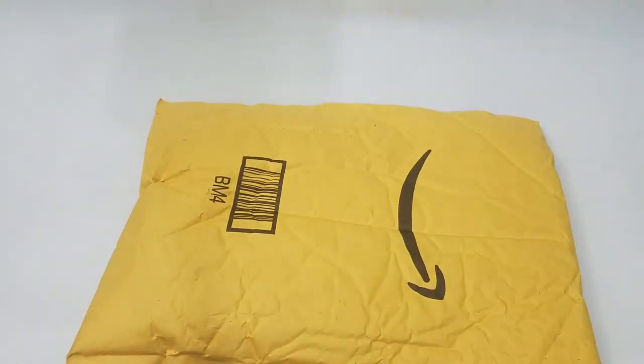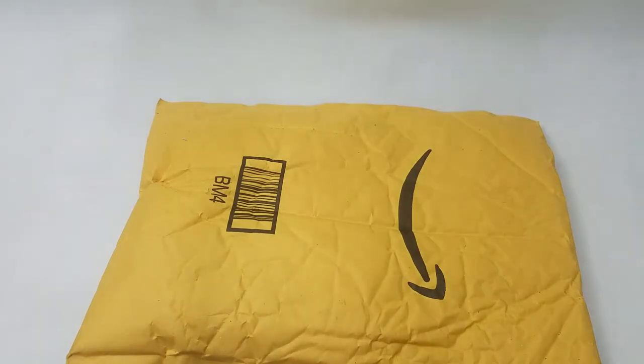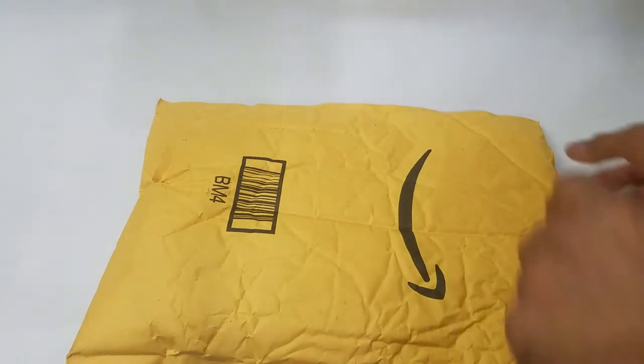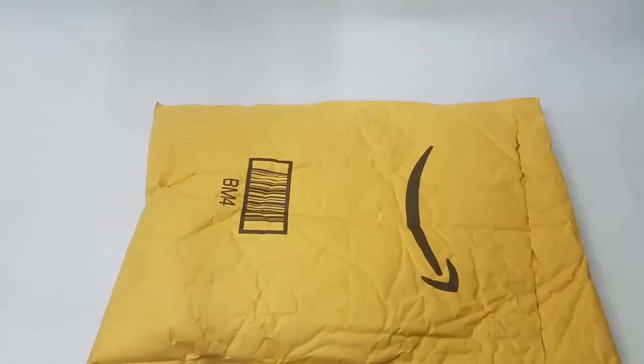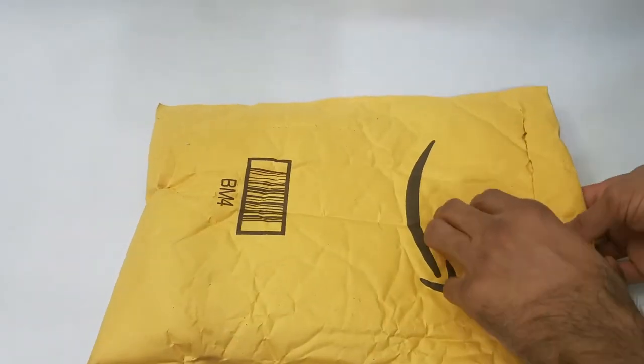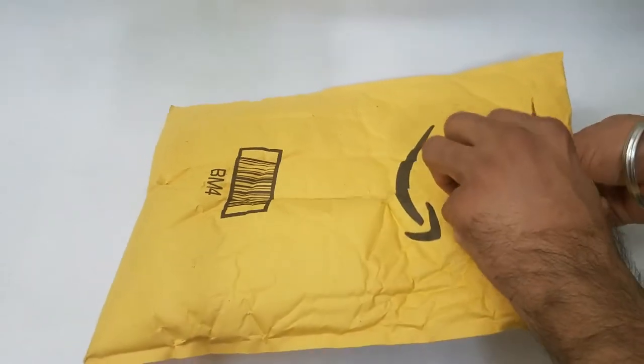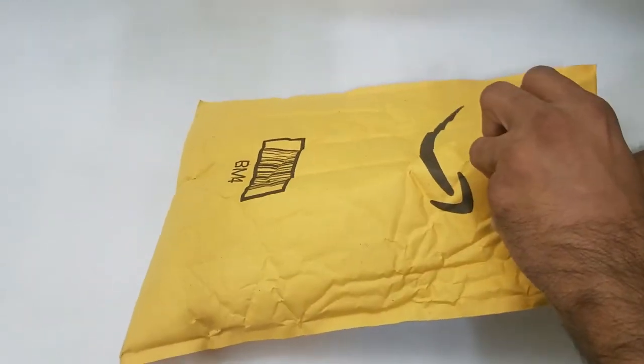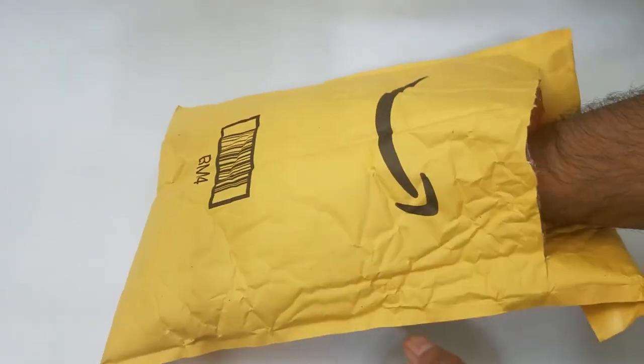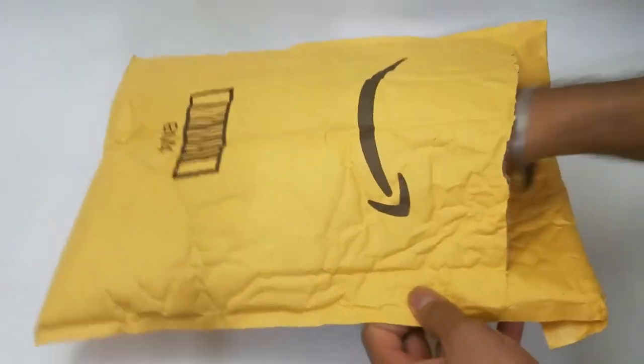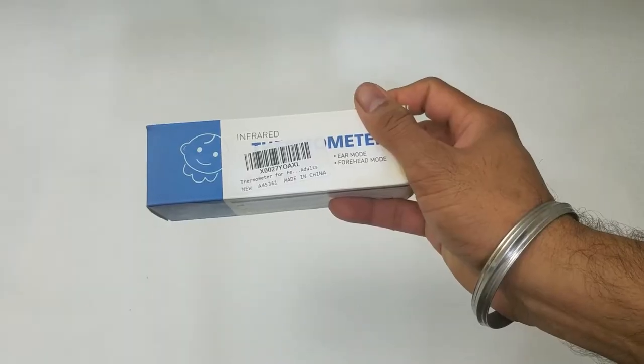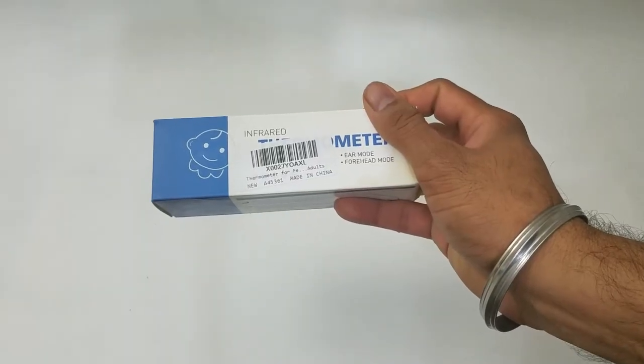What's up people? Manorat here, coming to you with a video. This time we're going to be unboxing and reviewing a must-have flu season item: an infrared thermometer.